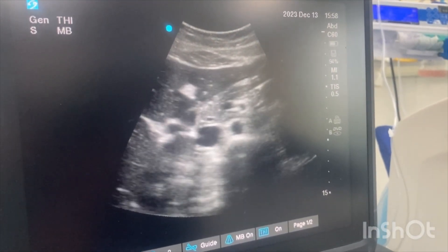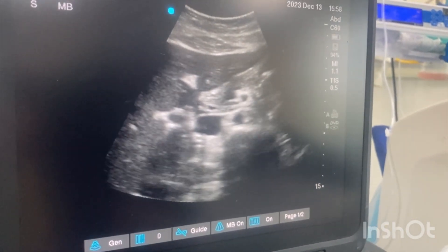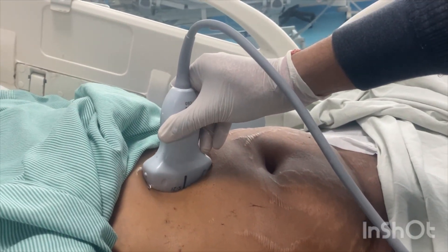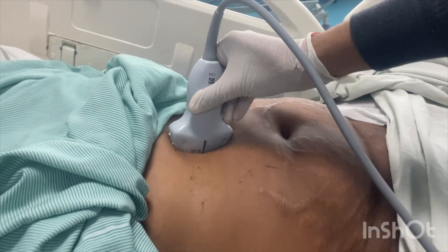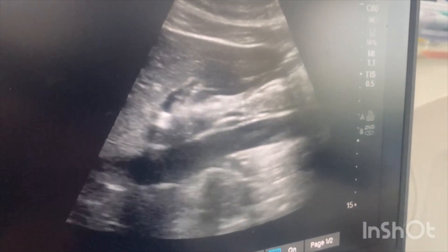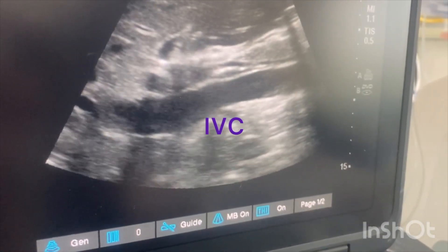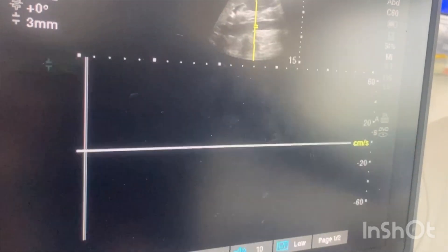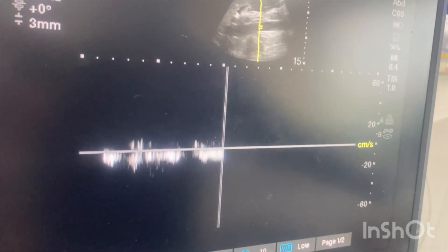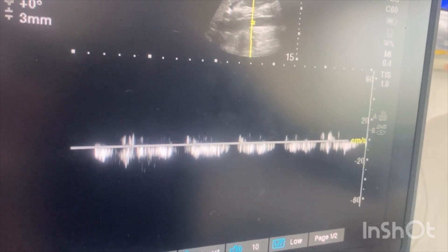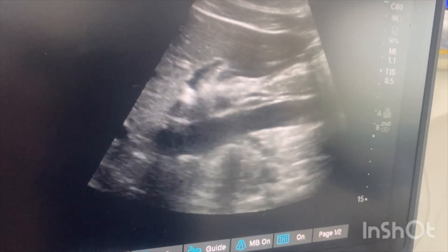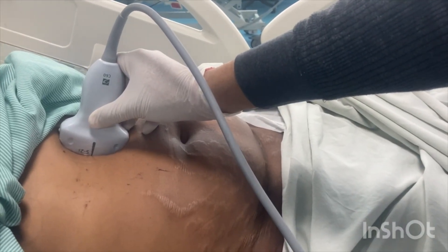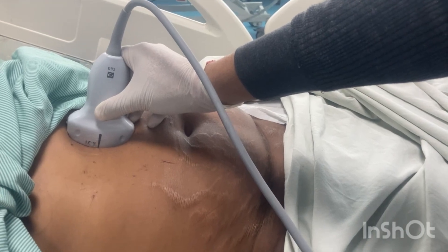After getting the cross-sectional view of the IVC and aorta, you have to rotate the probe, keeping the IVC in view with the orientation marker pointing cranially. You will see the longitudinal view of the IVC. Then apply Doppler and you will see a non-pulsatile waveform, which confirms that it is the IVC.